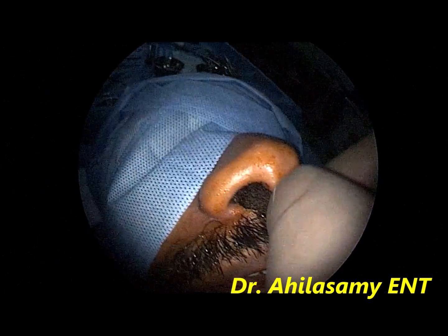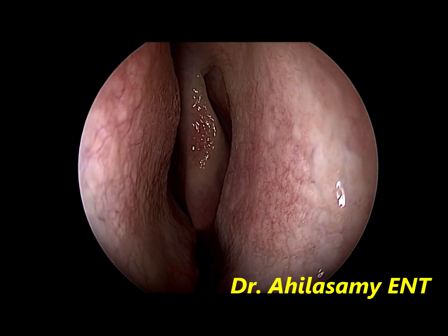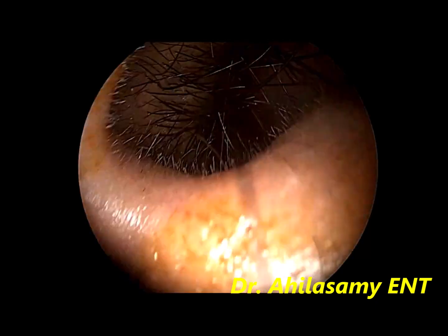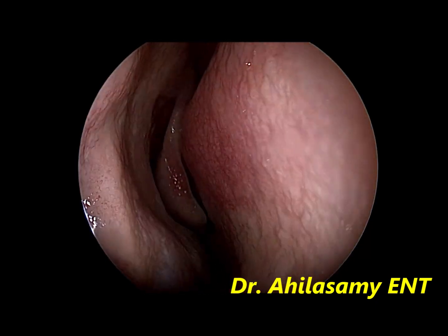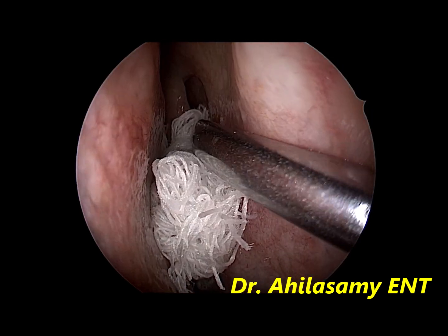This patient, a young man, is taken under local anesthesia. The nose has been previously packed with 4% lignocaine and adrenaline in the ratio of 1 to 1 to get a good decongestion. I will be performing a septoplasty and a posterior nasal neurectomy in this case.